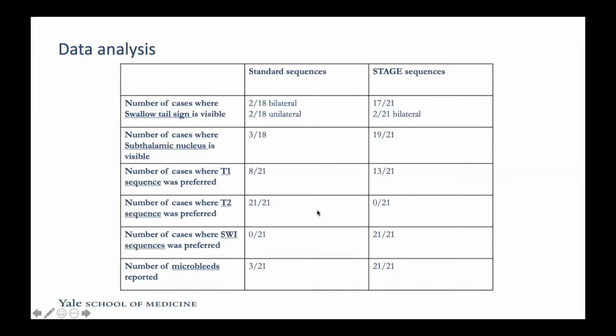And this is really interesting as well, because it means that this is a very good tool that we can use in clinical practice, but it needs a lot of improvement before it can be utilized, of course. But if we can utilize this, it's a very good improvement because it's faster. It does a lot of things automatically, like calculating volumetrics of the brain or segmenting the brain automatically, and also you can calculate microbleeds automatically. So this is very good.